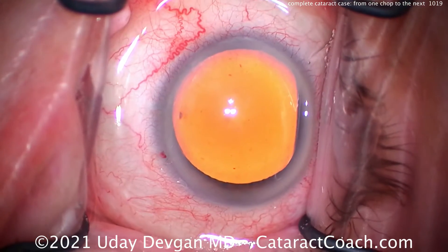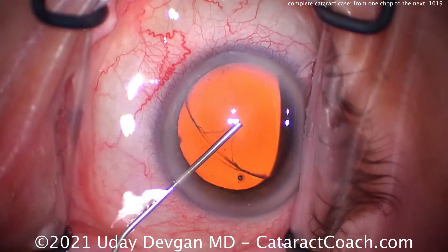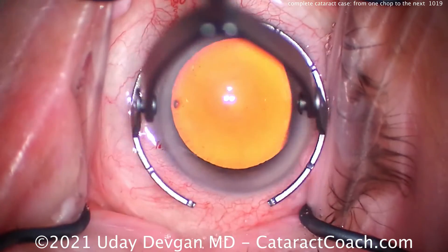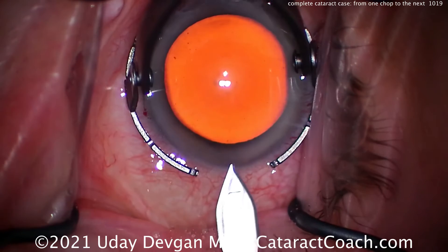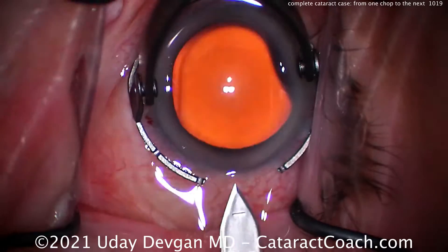Cleaning up the surface of the eye, we'll put in our dispersive viscoelastic and get a nice good fill — here's the big fill coming across. Now in this case we're going to use a steel keratome. We're going to make a nice single-plane incision, starting right there at the gray line, nicking those limbal vessels, just barely good tunnel length — and there it is.